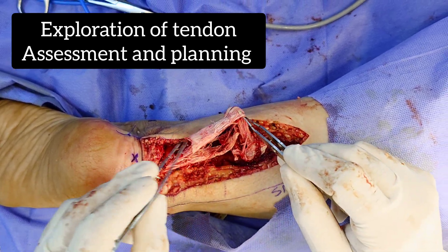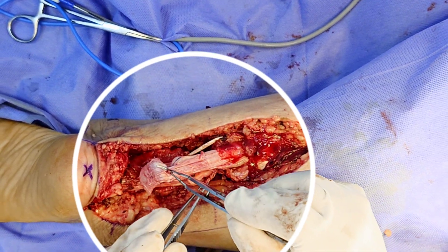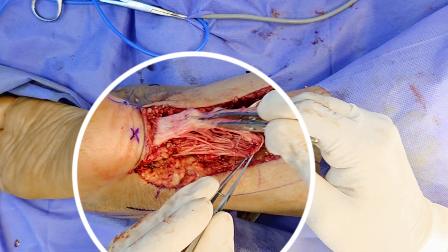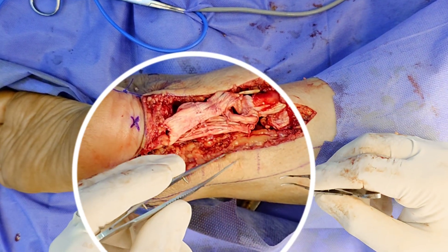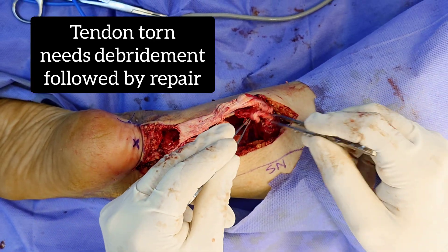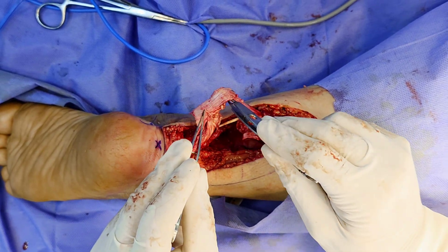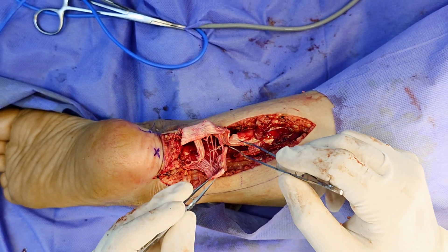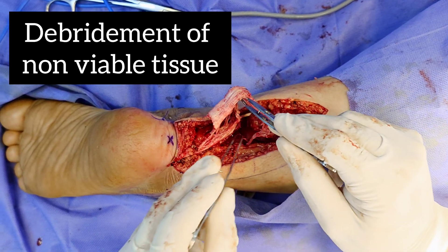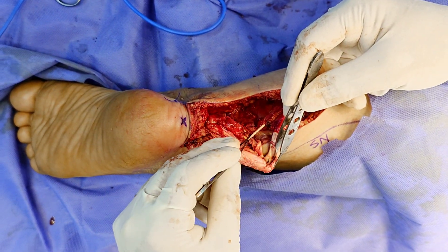We have explored the area. You can see the tendon is completely torn and the injury has occurred exactly at the watershed area, which is 4-6 cm proximal to the insertion of the Achilles tendon. We have localized the sural nerve and will try to avoid dissection in that area to prevent injury. The proximal and distal stumps will be separated, and non-viable tissue will be debrided conservatively — otherwise we would need to keep the foot in more plantar flexion, adding stress to the anastomosis.